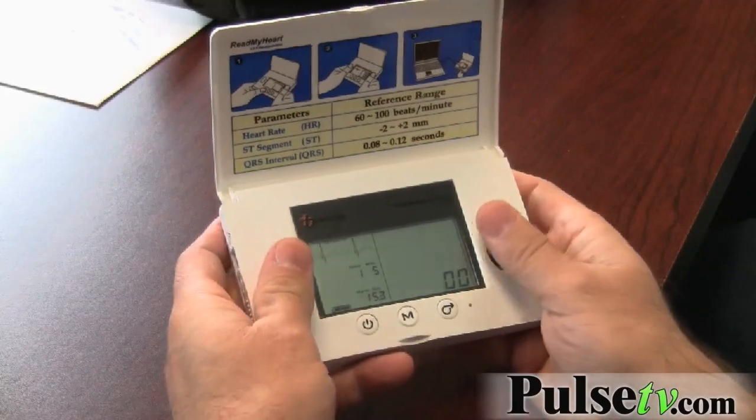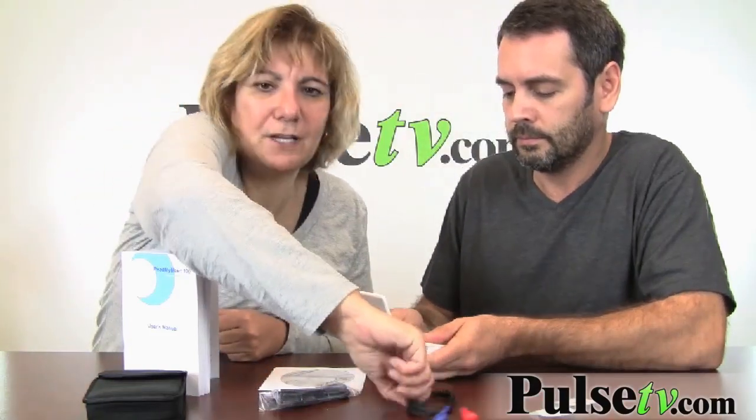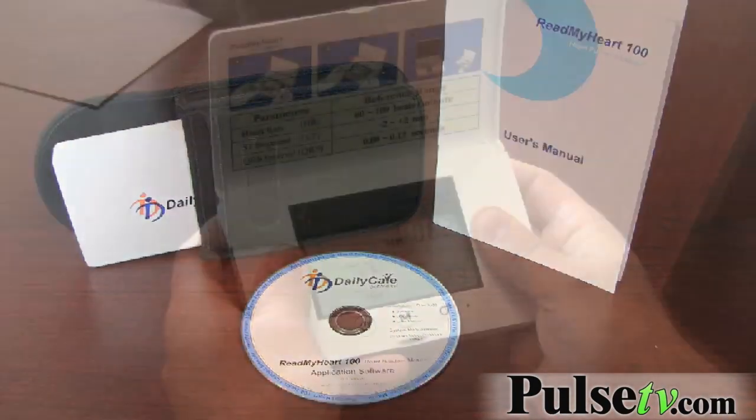You press the start button here and as soon as the monitor lights up you press your thumbs on here — it runs for about 25 to 30 seconds. In case you get a funky reading or can't get a good reading, it also comes with external electrodes that you can hook up to your arm; it explains it all in the booklet.